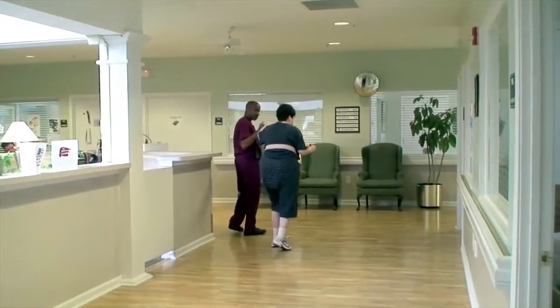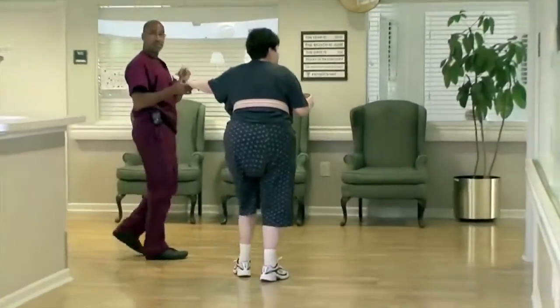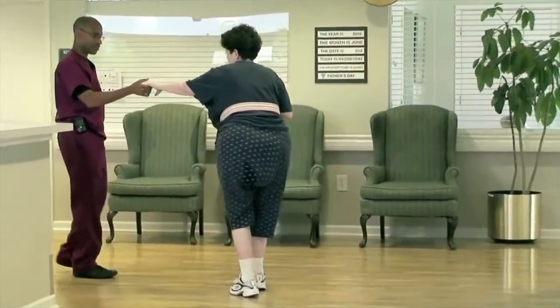Her stride length was a lot more consistent, and the pace of her gait was a lot quicker. Normally she's really just on her toes, but she actually had a little bit more heel strike and a little bit more continuity and consistency with her walk.